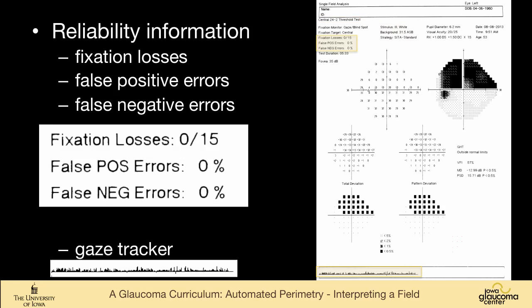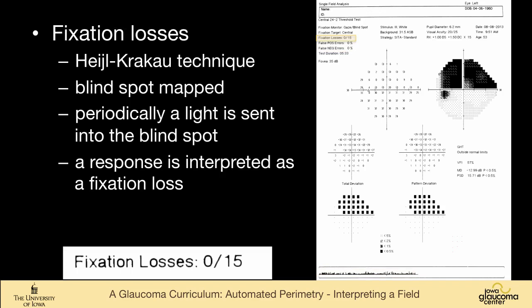We want to make sure that the field is reliable. So there are four reliability parameters on a SITA field: fixation losses, false positive errors, false negative errors, and the gaze tracker.